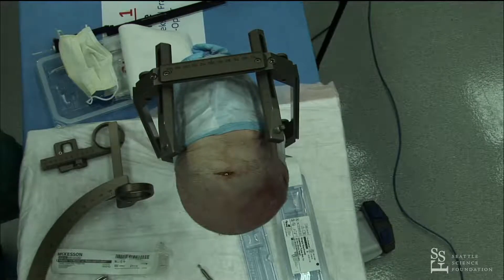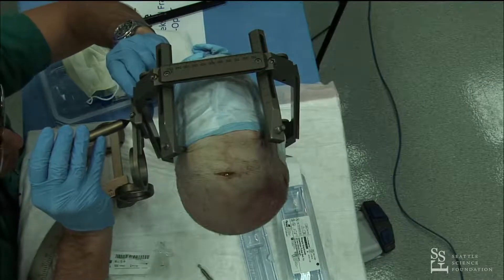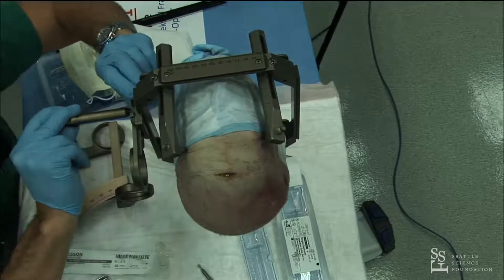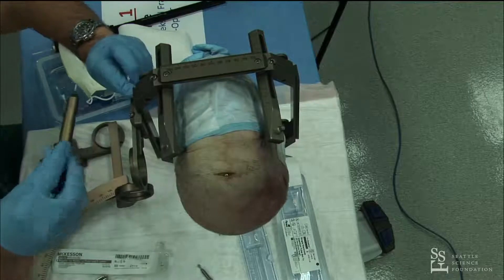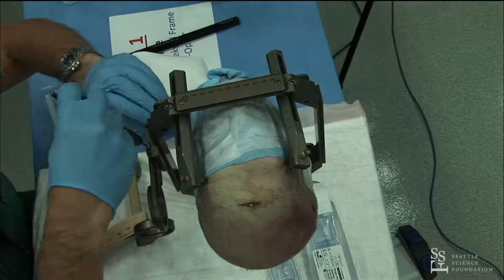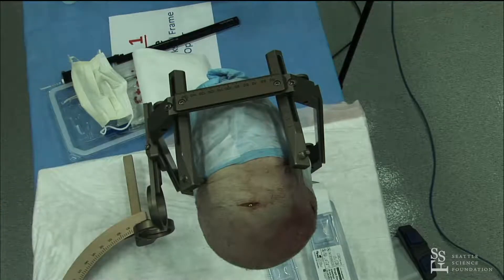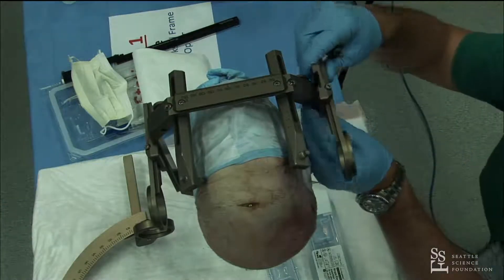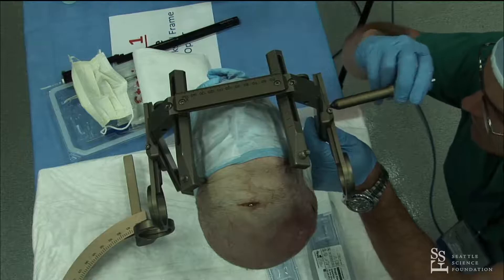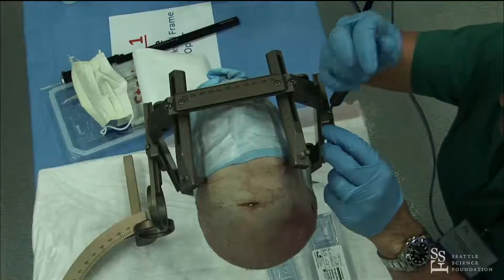So this will be our Y is 112. With this system, you've got to keep an eye right on the side so you don't get any parallax. 112 on Y, and Z is 106.5. This is where human error can definitely be a factor, and it's good to have somebody double-check — check, double-check, triple-check. 112 for our Y, and 106.5 for our Z.